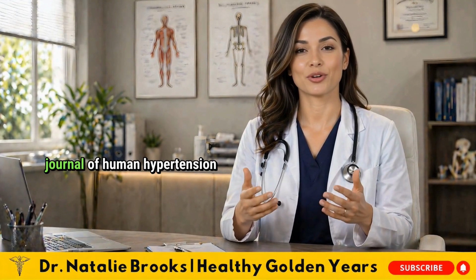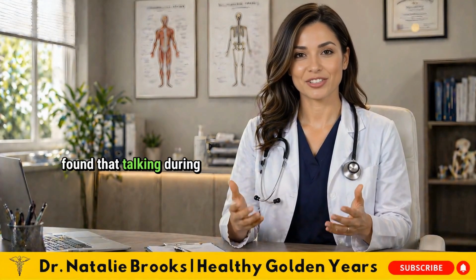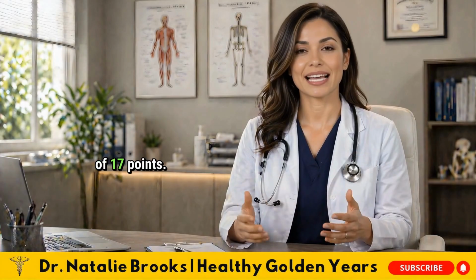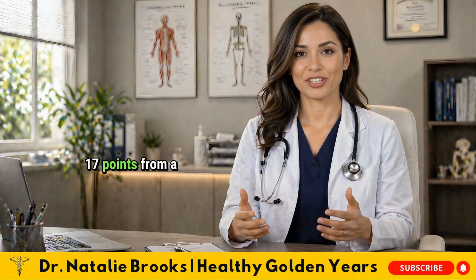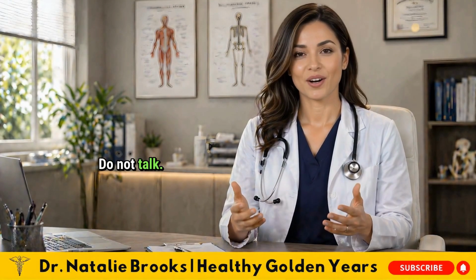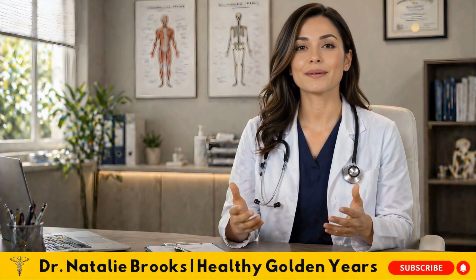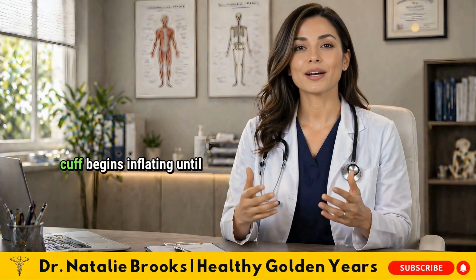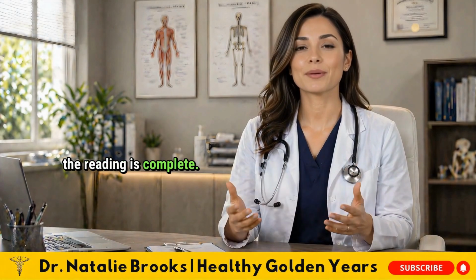A study in the Journal of Human Hypertension found that talking during measurement increases systolic blood pressure by an average of 17 points. 17 points from a single sentence. Do not talk. Do not adjust your position. Do not look at your phone. Remain still and silent from the moment the cuff begins inflating until the reading is complete.